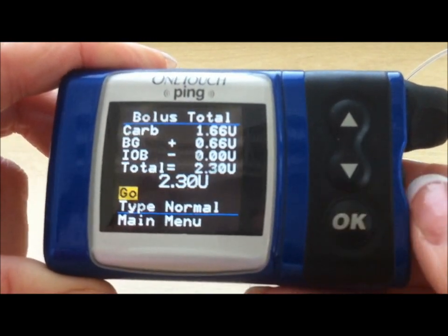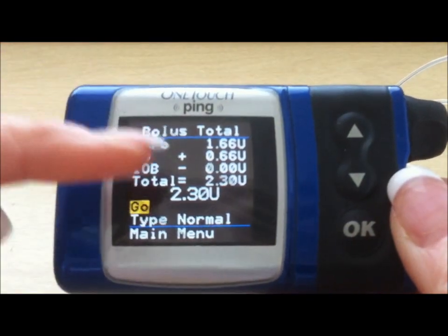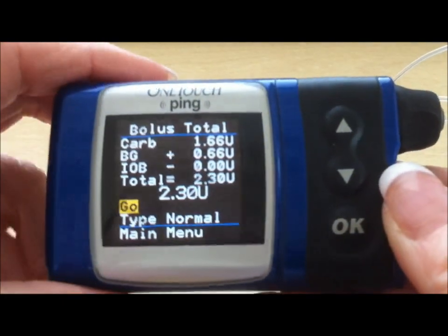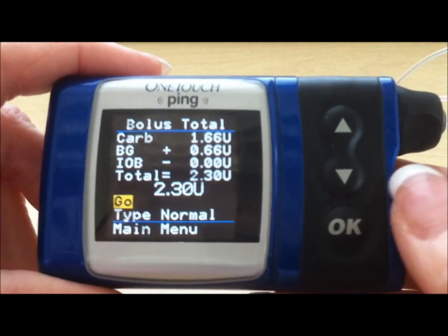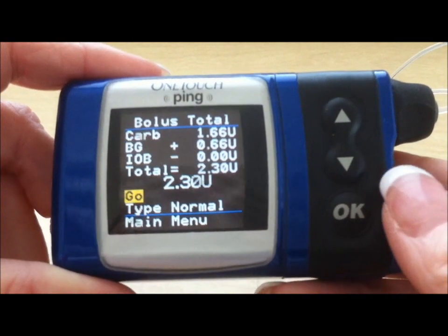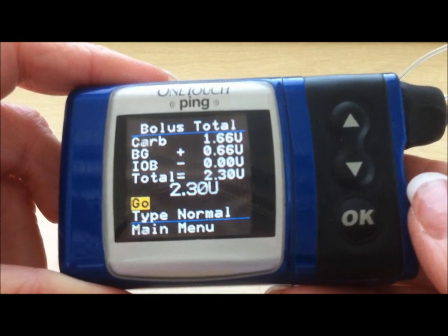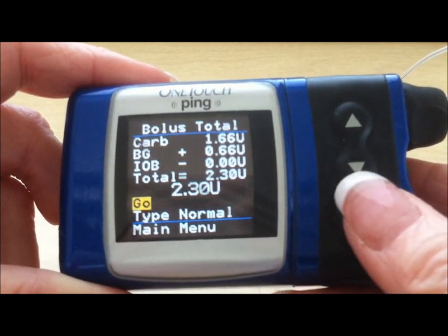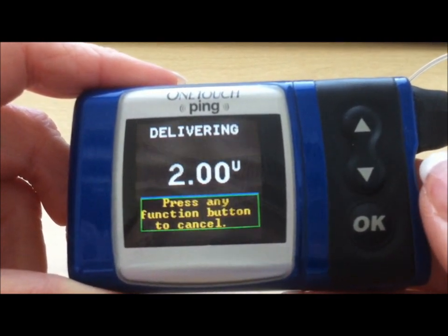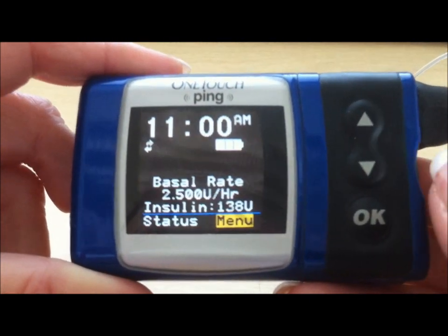You press OK and it will drop to the go button, giving you an opportunity to double-check that the recommended amount is the amount that you chose. For younger children, or in a camp or school environment, we usually ask them to check with a responsible adult to make sure those numbers coincide, because 2.3 can look a lot like 3.2. You press the go button and you'll hear a humming as the insulin is delivered. Then the pump will beep at the end, and it's all done.